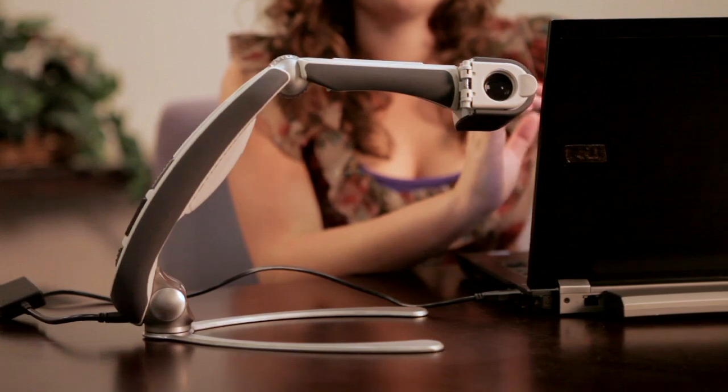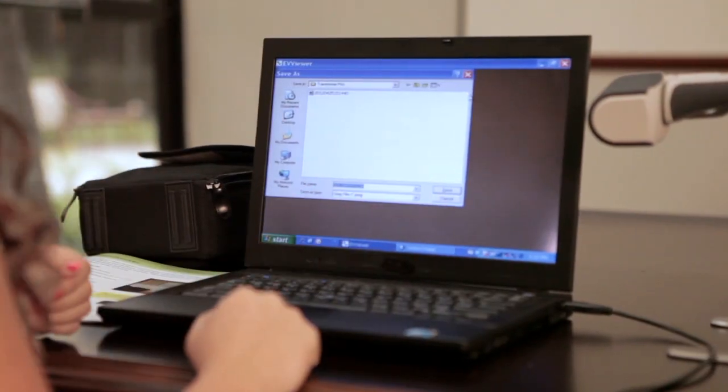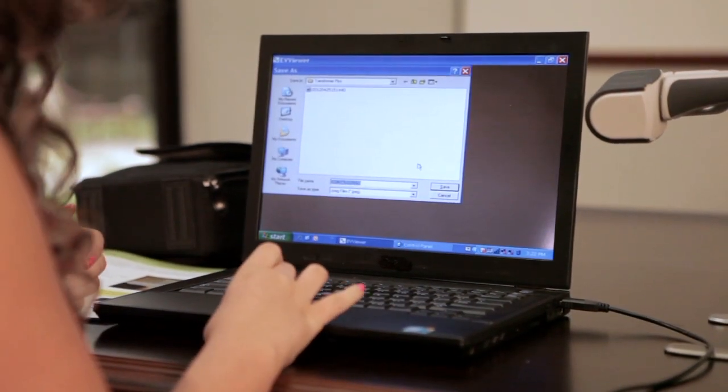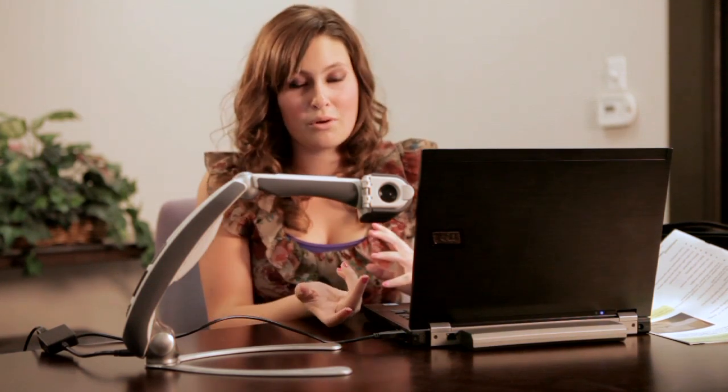Also, by pressing F5, you can go ahead and save the frozen image onto your computer files. So when I refer to it later, I can zoom in even more.